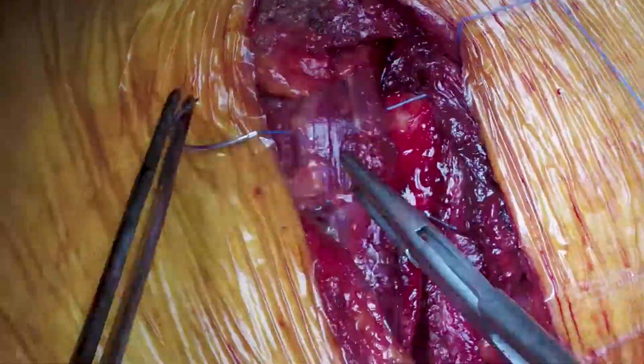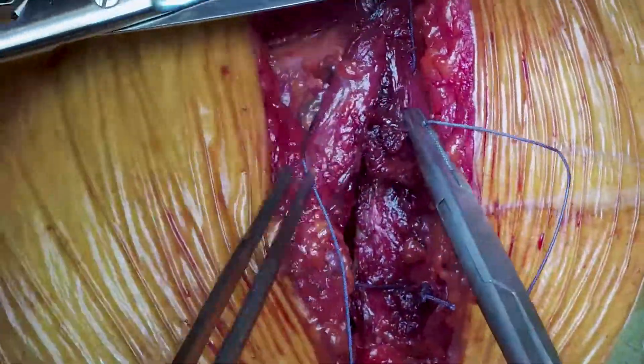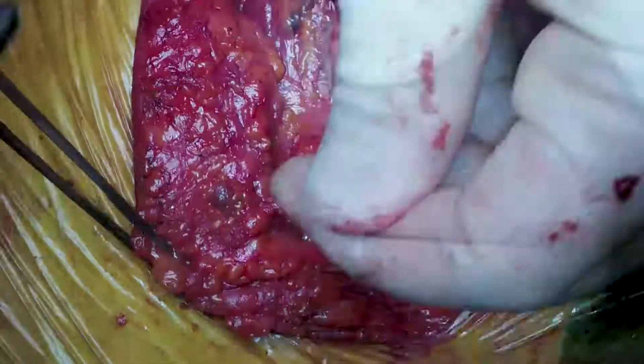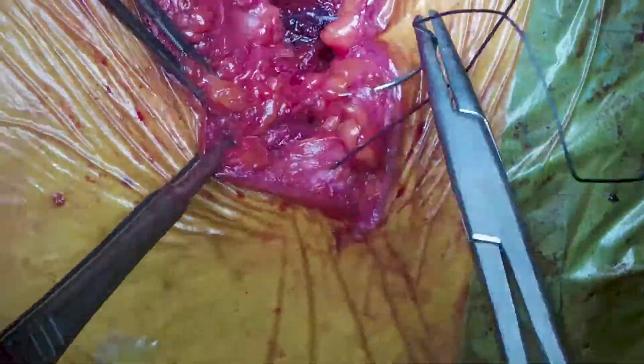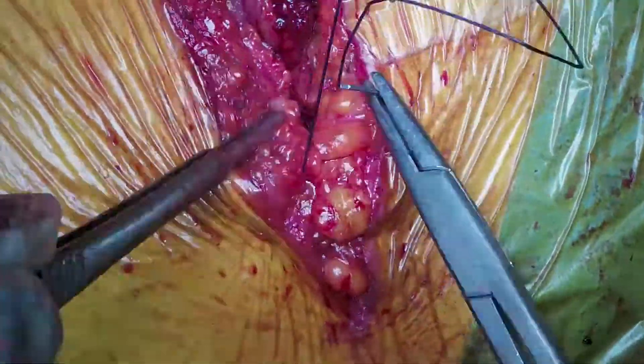We're using a number one polysorb suture to bring serratus anterior back together, as it was cut along the line of its fibres during the anterolateral thoracotomy in the first video. We don't need to do anything with latissimus dorsi because we didn't cut it — that was the entire point of the undermining and flap creation in the first video. As a result, the patient will have a quicker post-operative recovery, having only cut through the smaller serratus muscle group rather than two large muscle groups.